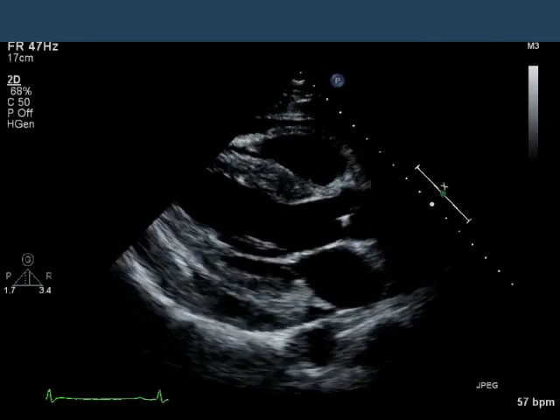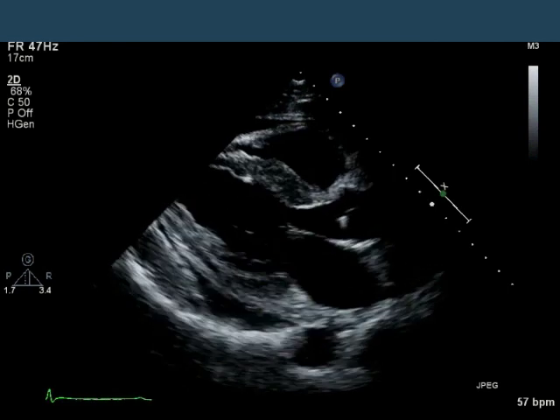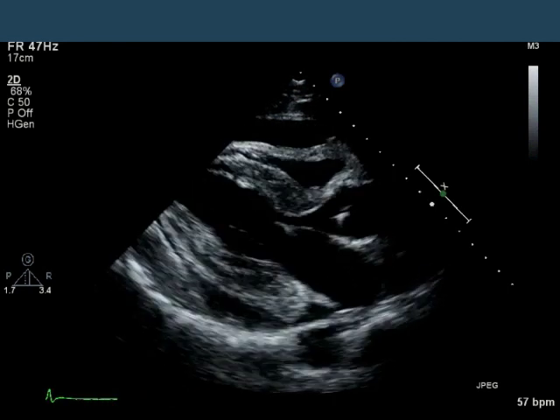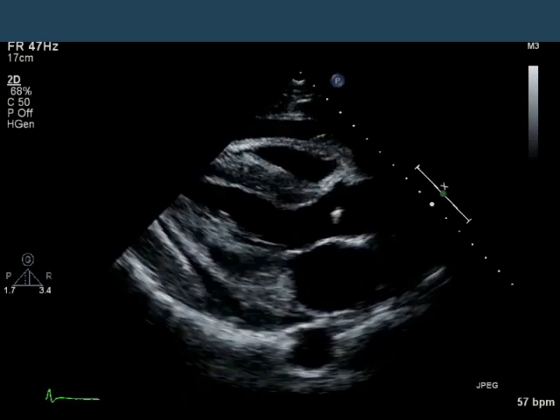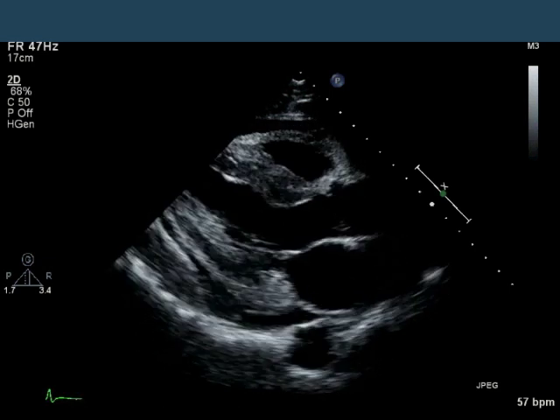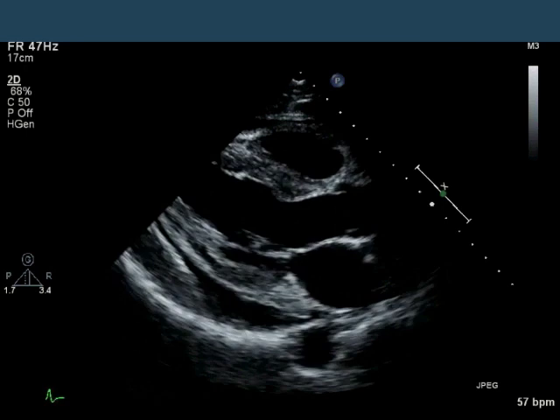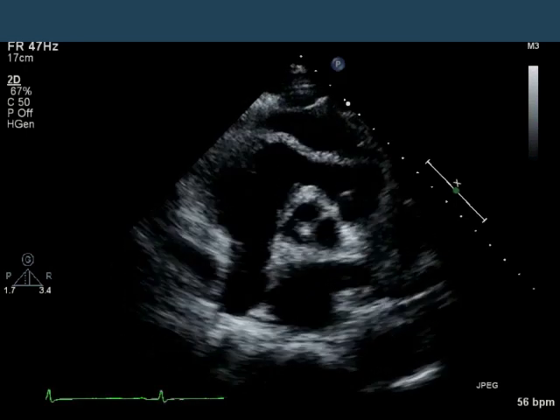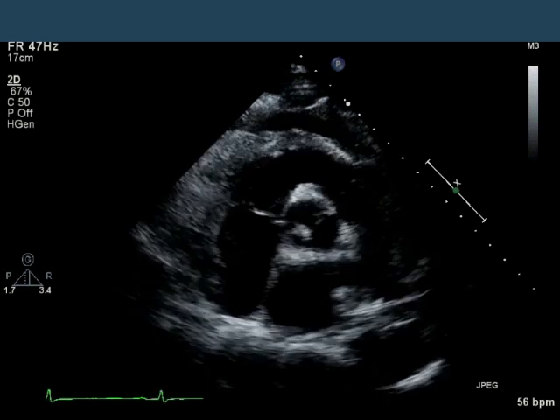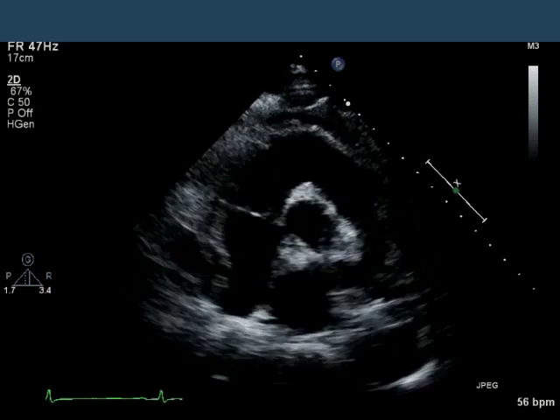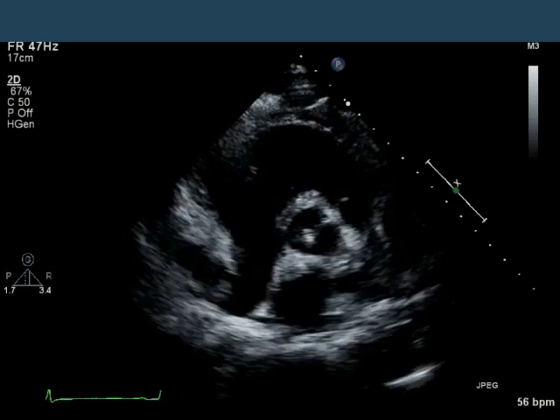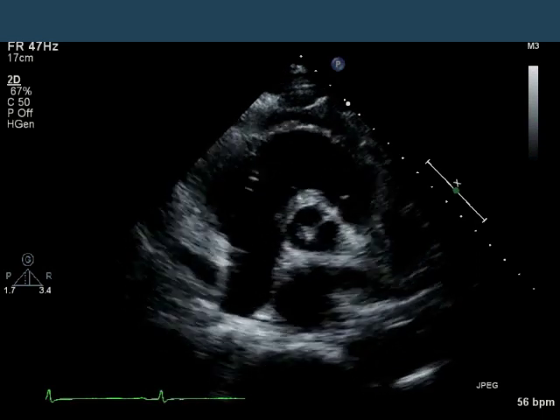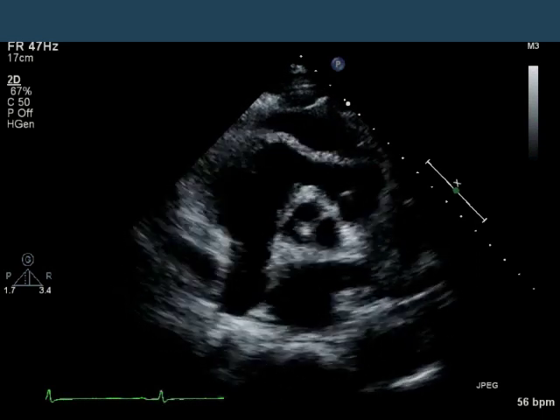Here's a parasternal long axis 2D image. You can see that the LV systolic function is good. The RV systolic function looks good. And if you look closely, there's some early diastolic collapse of the RV free wall. In the next slide, this is now parasternal short axis at the level of the aortic valve. And again, you can see that there is some early diastolic collapse of the free wall of the right ventricular outflow tract.